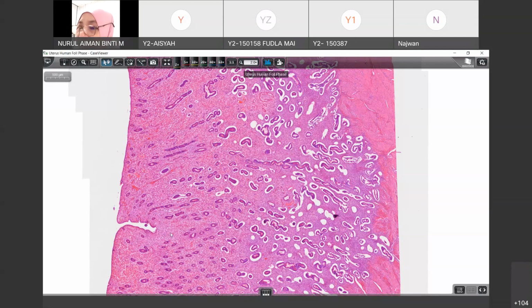Actually, what Hadi wrote, we have endometrial layers. So the uterus is divided into 3 layers. The endometrial, what are the other 2 layers? The endometrial layer, this is the endometrial layer. What are the other 2 layers? What is this layer? Anyone want to answer?